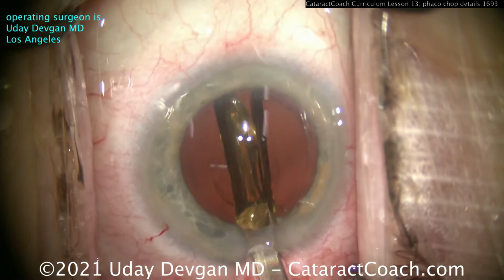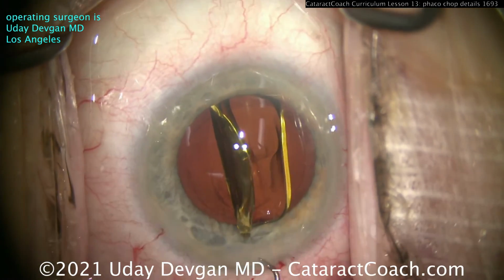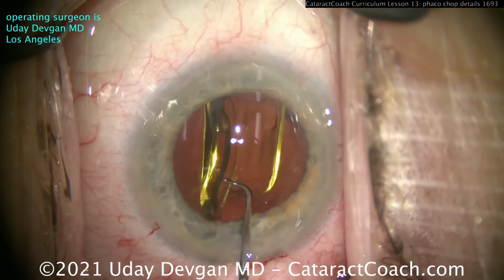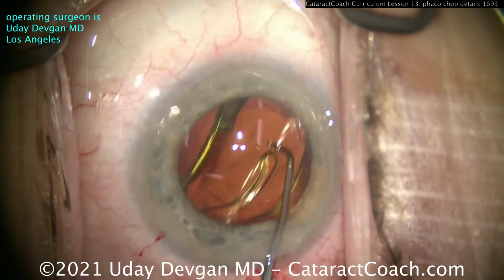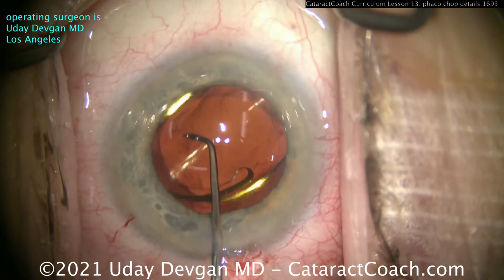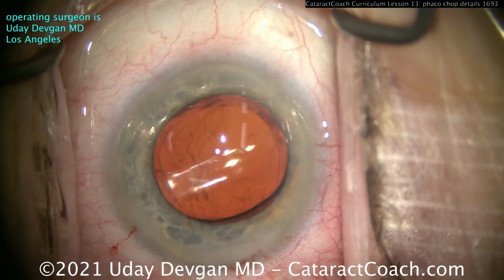So let's deliver that lens into the capsular bag. Looks pretty good. My technician's spectacular. She's loaded that up perfect every time. And now let's just get that lens into position, open up the haptic. You can see this is a small hyperopic eye. This lens power is 24.5 diopters for a plano outcome.